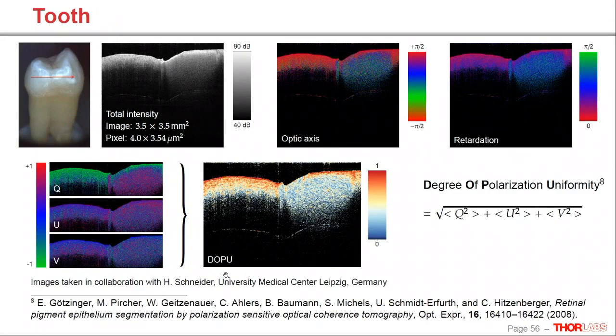And one good sample for that is teeth. So we've taken a tooth here, and the tooth has some carious lesions that you see here in these white bright spots. So we're scanning along the red line here again. So we have some healthy tooth that is highly structured tissue normally, with crystalline structure even to take up the load of daily use of the tooth.